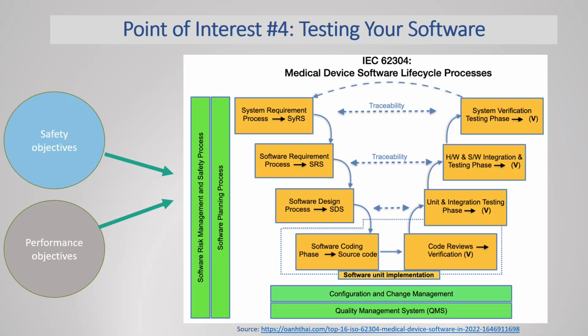One of our webinar friends sent in a great related question. Are there any special considerations for medical device software using MDCG 2020-1? That's the clinical evaluation guidance under the MDR and IVDR regulations when developing safety and performance parameters.